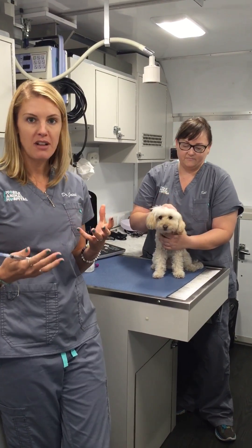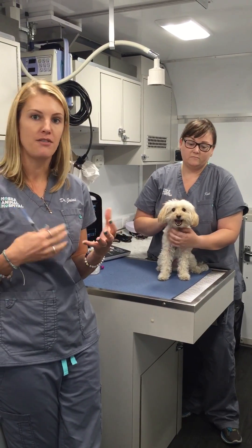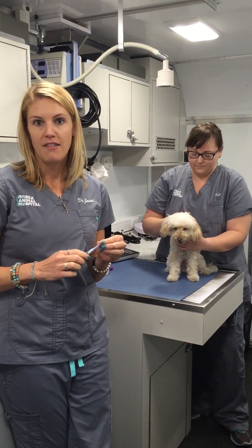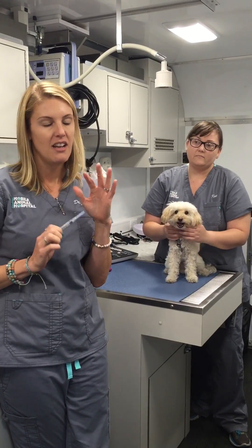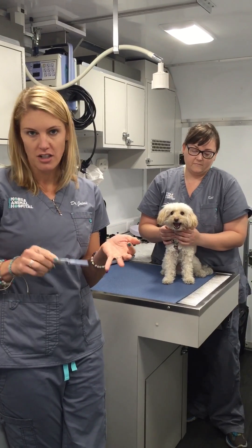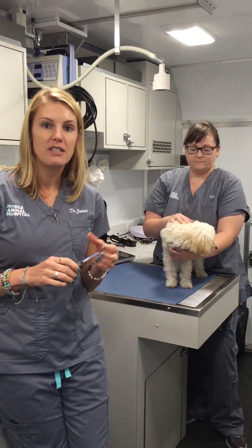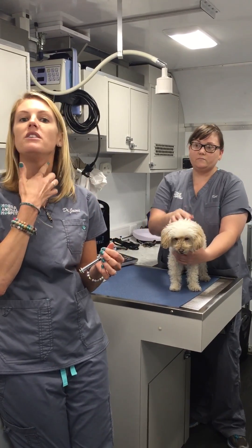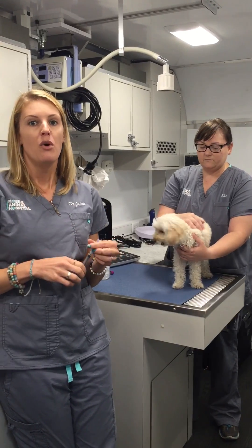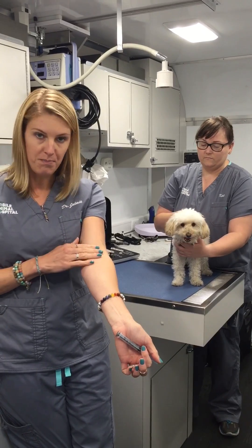It's a little disconcerting for some clients because dogs are different than people. Their anatomy of their neck is different. In a person, if you were to jab them in the neck, you're going to hit the carotid artery — that would be a big deal, probably would hurt and cause a lot of bruising. But in animals, their carotid artery is actually very far back behind a muscle, and what runs right here is the jugular vein, which in a small dog like Mim is just about the same size as getting blood from your arm.